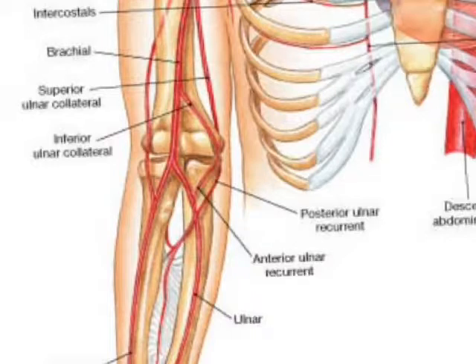Now we need to be thinking, if we're going to inject IV contrast into this area, the arm moves, right? So if I've got my IV south of this area and the patient does this, what just happened? I just kinked the vein. I just closed off the IV basically. So now if I'm going to use a power injector to inject through that, I'm running a real risk for extravasation, right? Interestingly enough, the exact same thing can happen, especially in CT, if I ask the patient to bring their arms up. Now I just potentially kinked it up here.